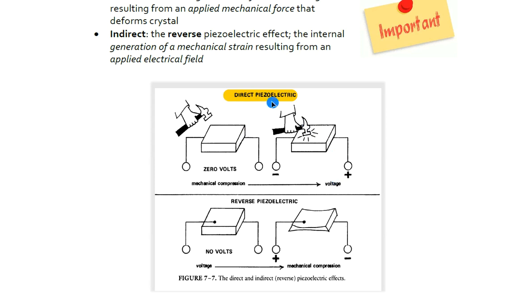For this reason, this is why in bone healing, it's important to have vibrations and weight bearing at certain stages to get the piezoelectric effect. Ultrasound uses what's known as the reverse piezoelectric effect. So now, instead of causing a mechanical vibration, which would create energy and sound, we're adding electricity to the rock, to the metal. That's what the ultrasound machine is doing as it sends the electricity through the cable, through the transducer, into the quartz substitute.